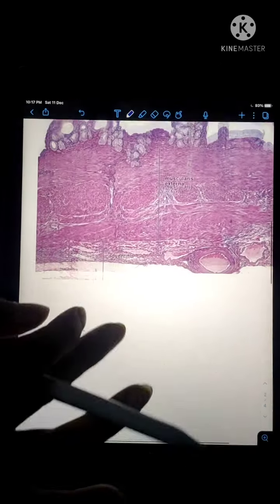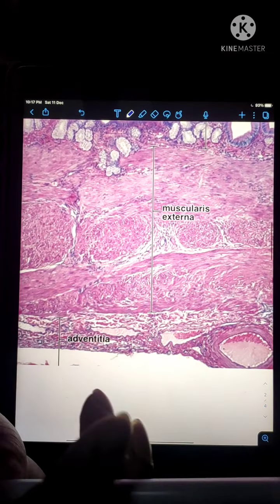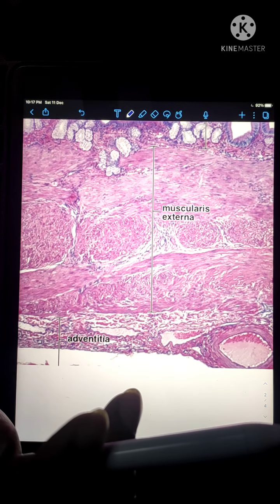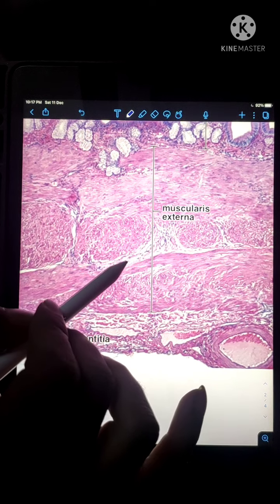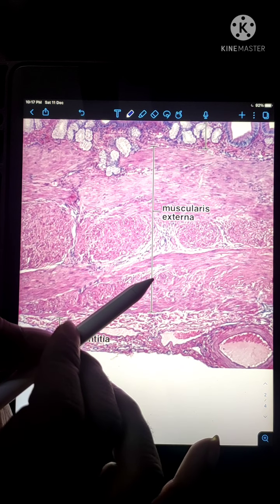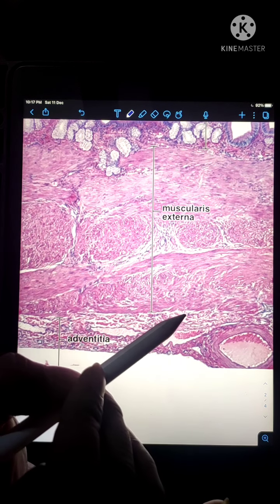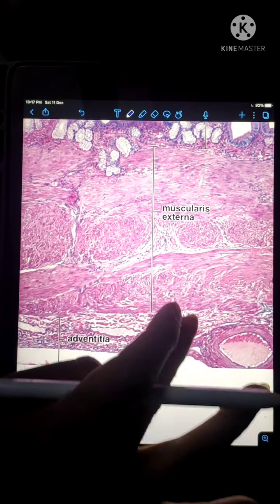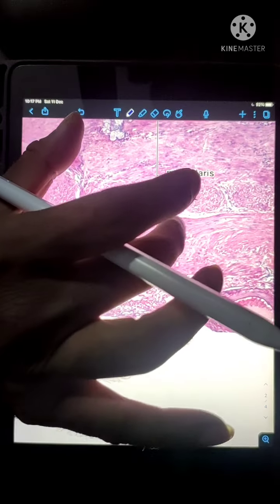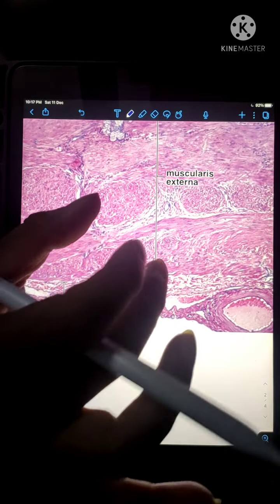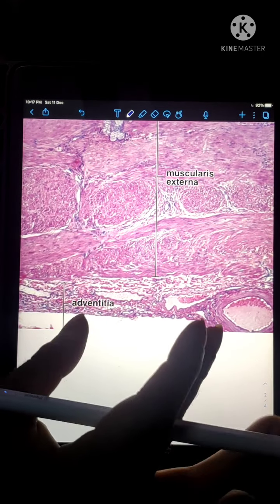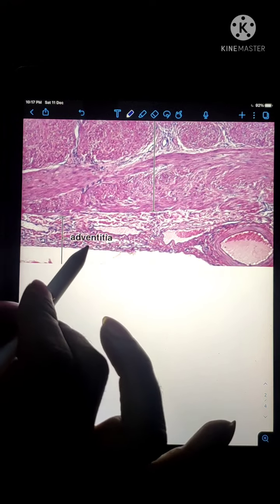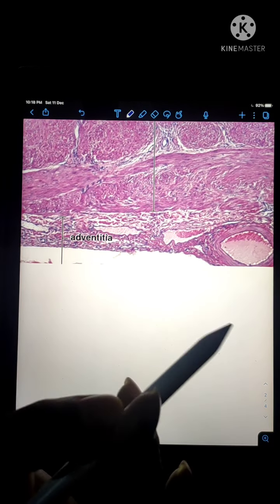The next layer is the muscularis externa, also called the fibromuscular layer. It is mainly composed of randomly arranged smooth muscle fibers. In between the muscle fibers, there is dense connective tissue which is rich in elastic fibers.